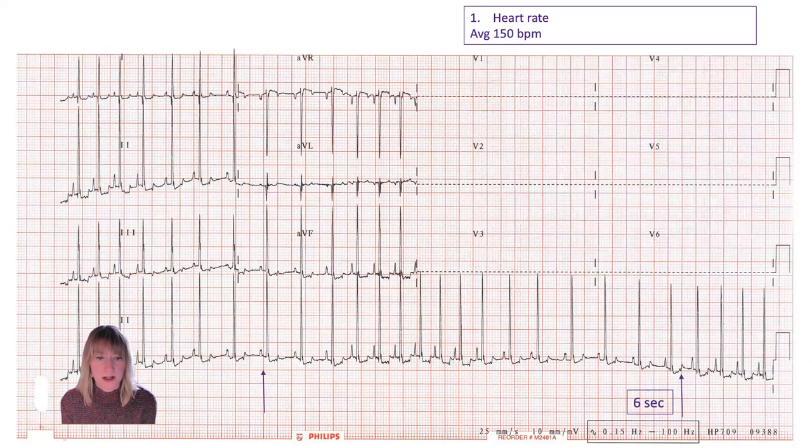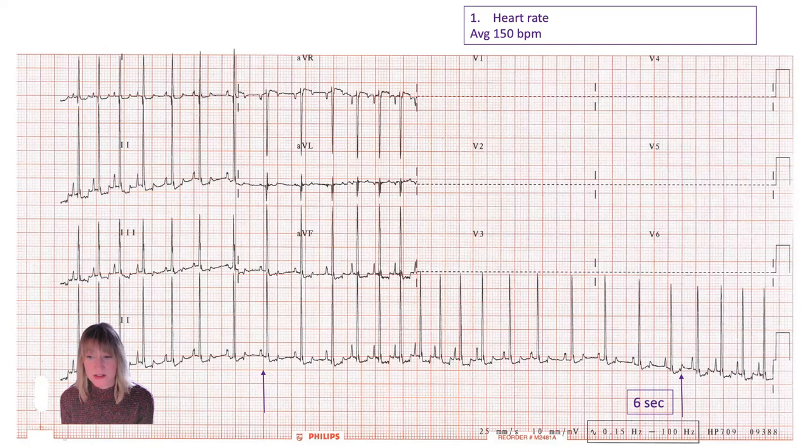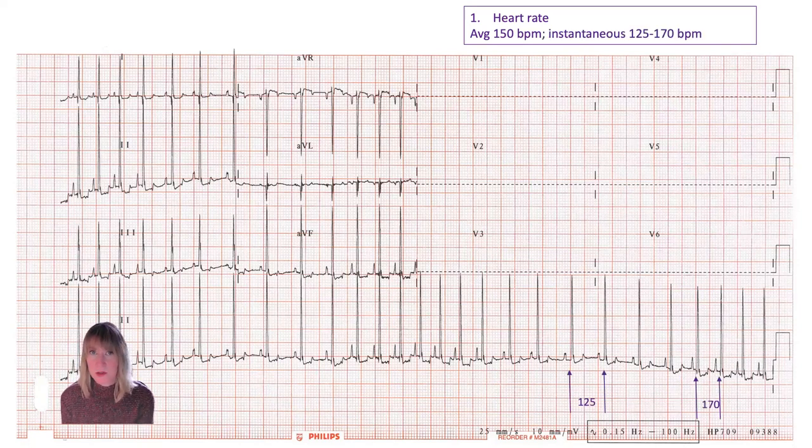If we start with heart rate, I know that the rate is changing, just visualizing it. I can see it speeding up and slowing down. I made myself a six-second ruler between the arrows, and if I count the heartbeats within that six-second ruler, I get an average heart rate of 150. That's one way I could approach heart rate. I could also still do an instantaneous heart rate. If I'm going to do that, I'm going to select a long cycle and a short cycle to give myself a range. When I do that using the 300 rule, I get between 125 and 170, so that gives me an idea of instantaneous range.